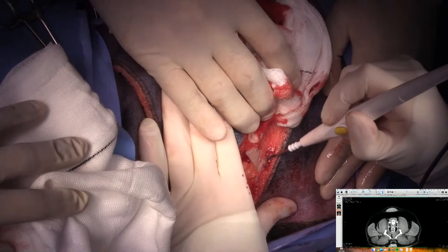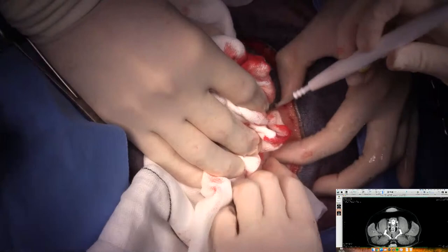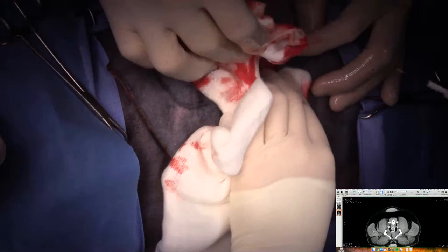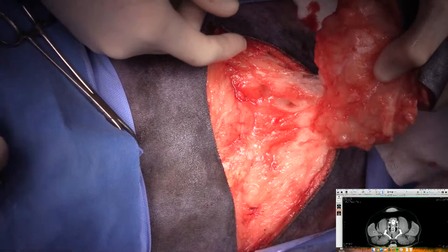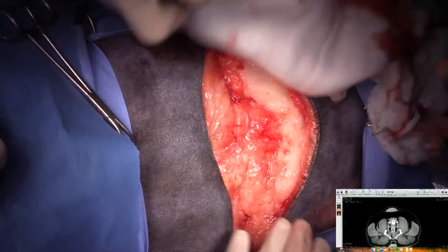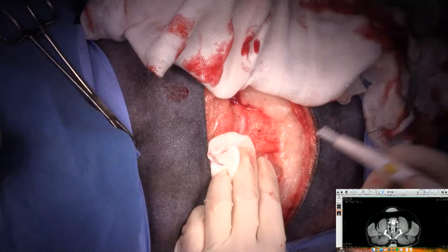Again, on this side, we're just diving right down onto the fascia through the fat, of which there's plenty. Okay, so we've excised the mass. We've got plenty of fascia all around underneath the tumor, so this is certainly going to be a clean margin. We will send it off anyway.